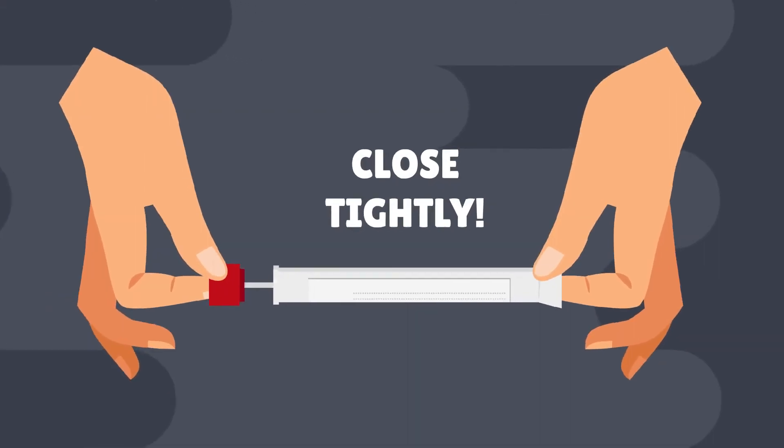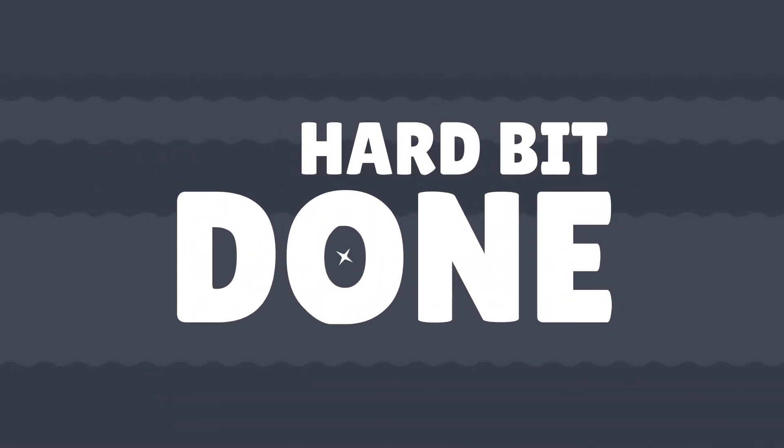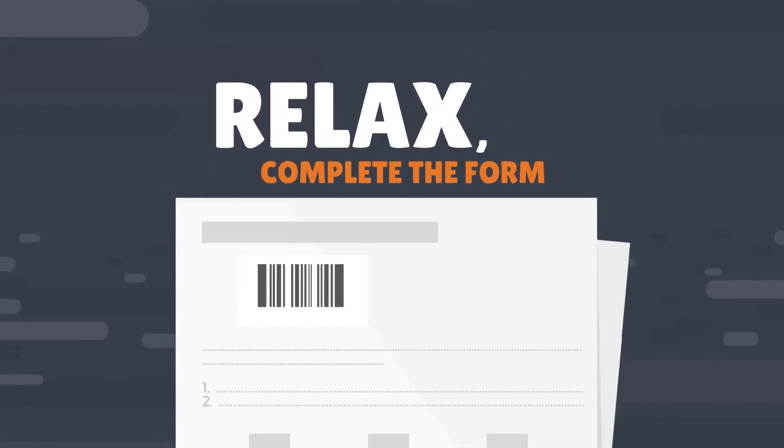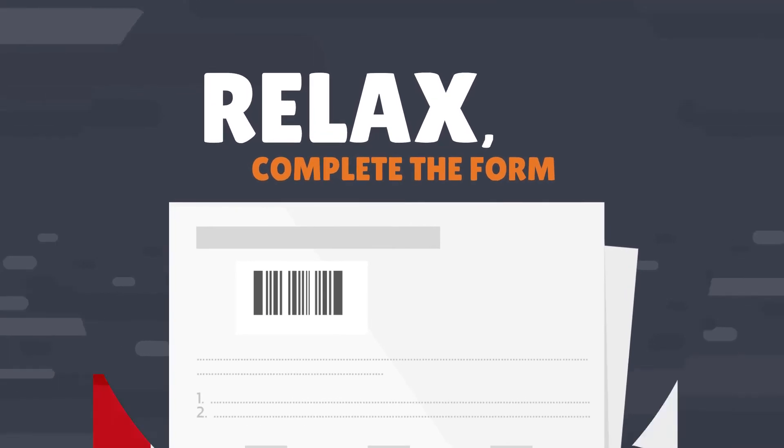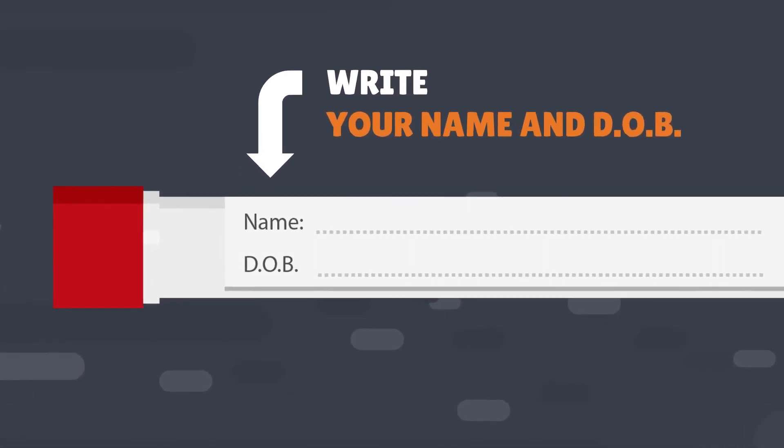Step 4. Place the used swab back in the tube and close tightly. That's the hard bit done. Now relax. Complete the form you found in the kit and write your name and date of birth on the swab tube.